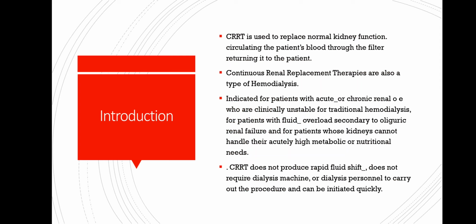Hi everyone. Today we are going to discuss CRRT. CRRT means continuous renal replacement therapy. First one, introduction of CRRT.